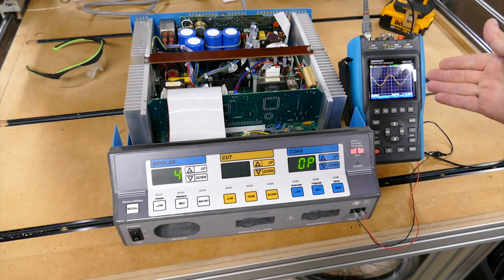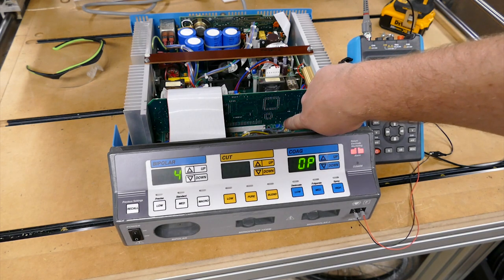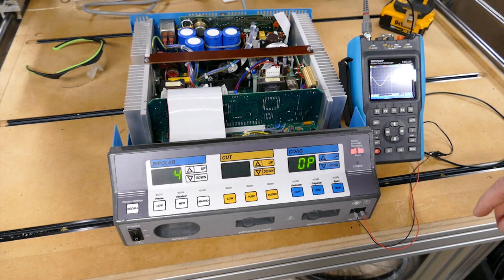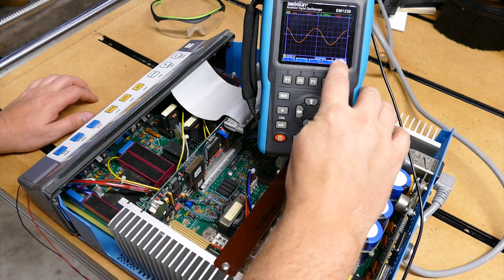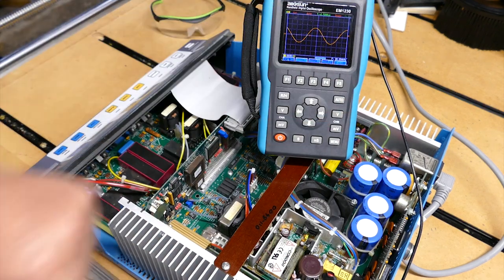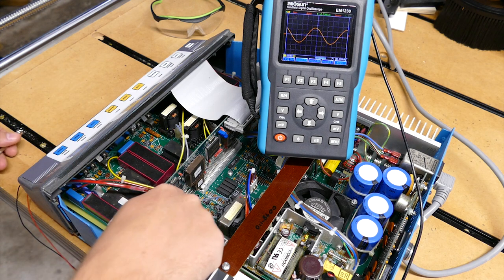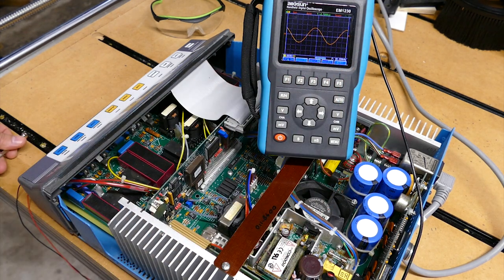Now we are ready to do a calibration to the potentiometer, which you might be able to see at the base of the card right down there. I'm going to flip it around so we can get a better view, and we'll go ahead and calibrate. I don't know if you can see it too clearly on the video, but right over here is my frequency of the waveform. It's currently at 80.25, and you can see I've got a clear signal. And what they request us to do is to adjust this little resistor down here, this potentiometer, and the frequency should read round about 82 kilohertz.